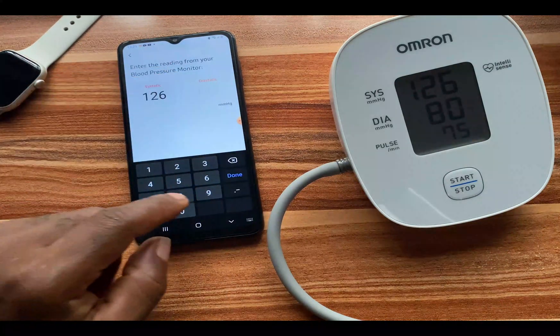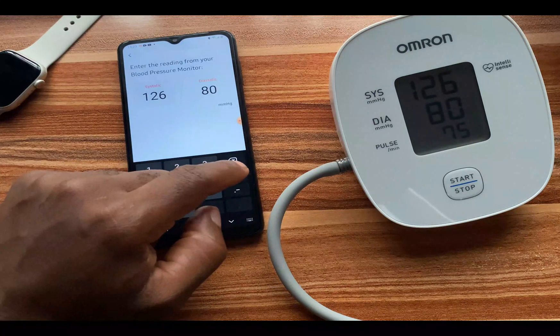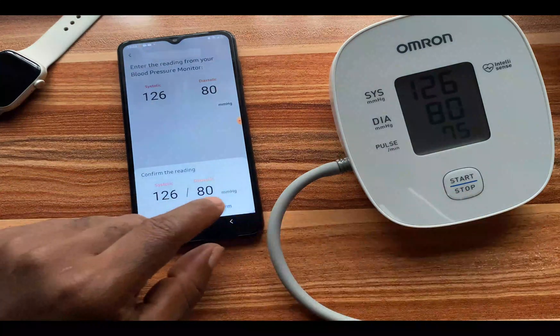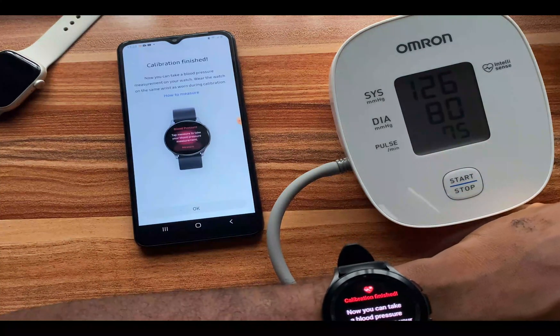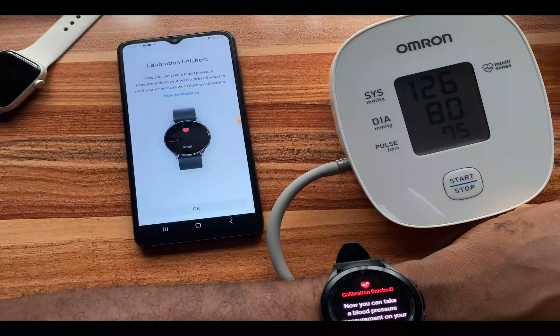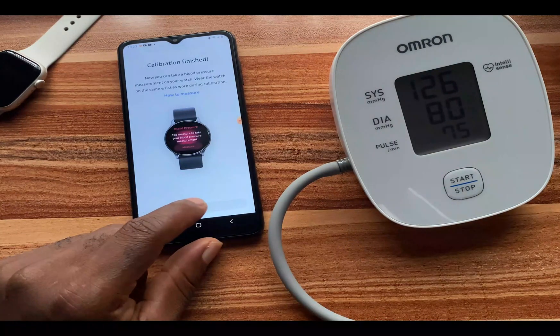The diastolic is 80. I tap 80 and tap 'Enter,' then confirm this last reading. It says 'Calibration finished — now you can take a blood pressure measurement on your watch.' It also says to wear the watch on the same wrist as worn during calibration. I tap 'OK' to finish.